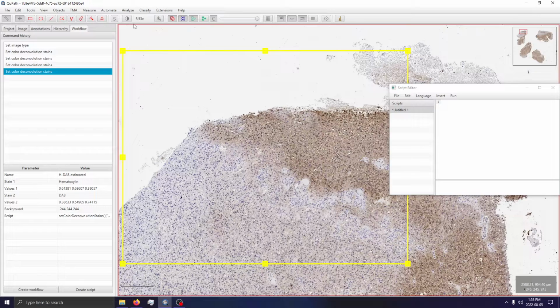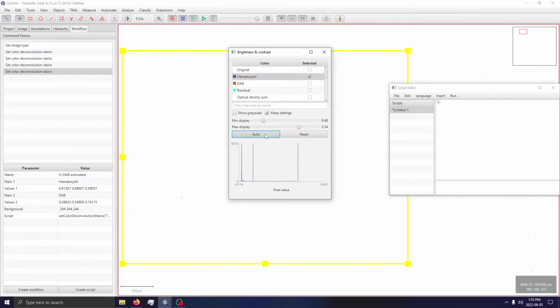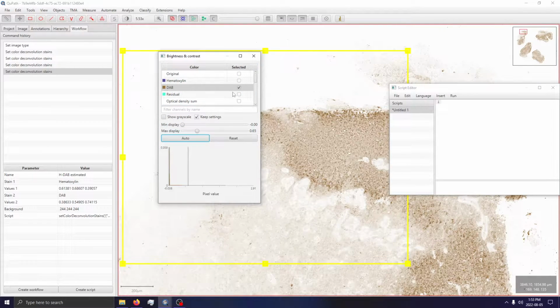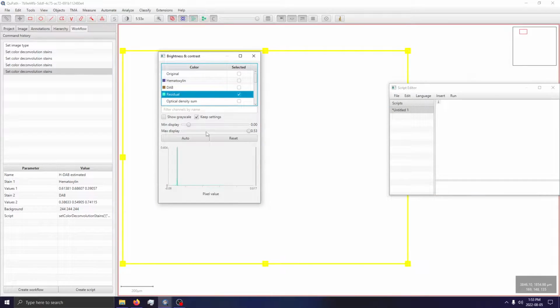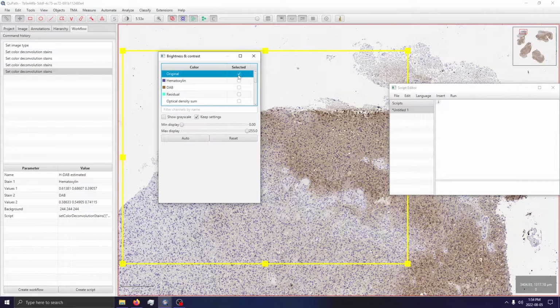Now, if we zoom in, we can start swapping between the hematoxylin channel, the DAB channel, and residual, but we don't really need to use that for anything. First off, what we're going to attempt to do is perform DAB detection using our Universal Stardist for QuPath script, and then we will work on having a custom built solution for cases where we have really intense DAB staining.